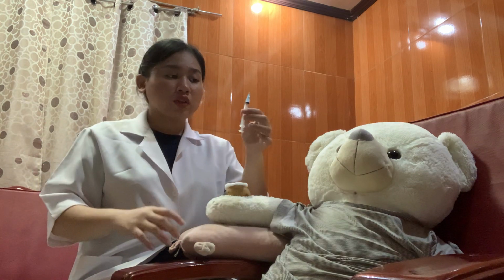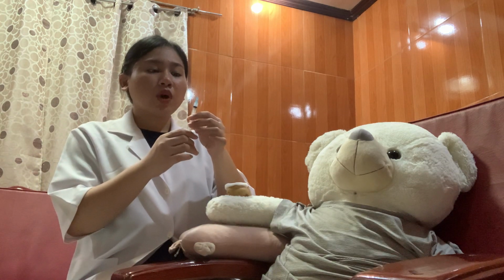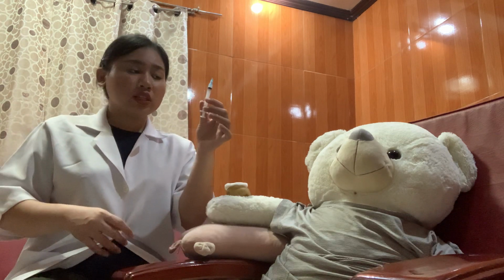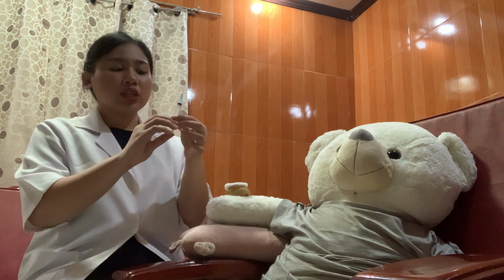After applying pressure, we protect the sample. We hold the syringe upright to express the air bubbles. Then we seal the needle immediately using the cap or the rubber stopper.